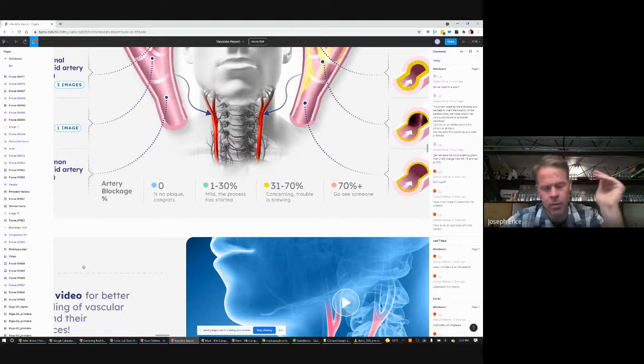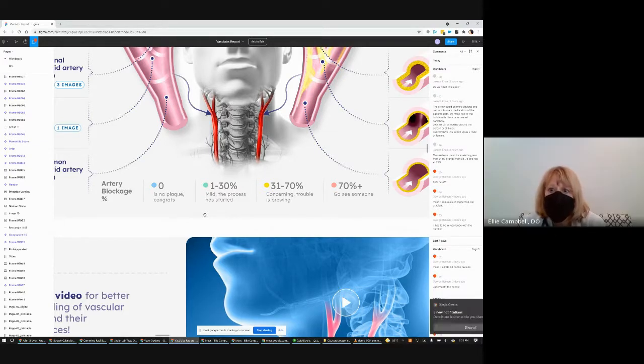So if they have no plaque and their IMT is under the 75th percentile, you're pretty happy, and they have no major medical history, you're pretty confident they're okay? Yeah. I mean, we still look at numbers, right? If they have elevated, I don't know, myeloperoxidase or Lp-PLA2, we're full court pressing. We're doing a dental evaluation. We're doing stuff, even if their CIMT is beautiful.